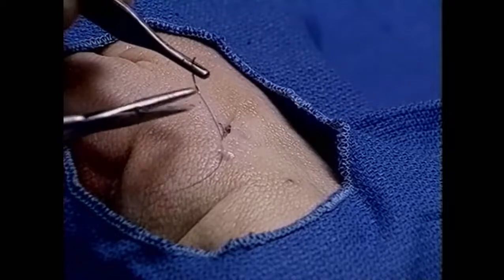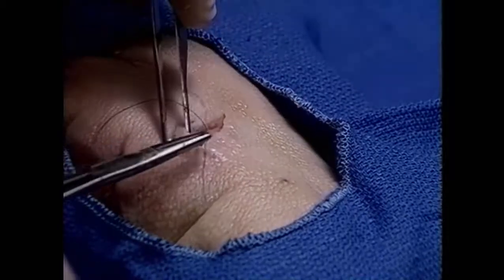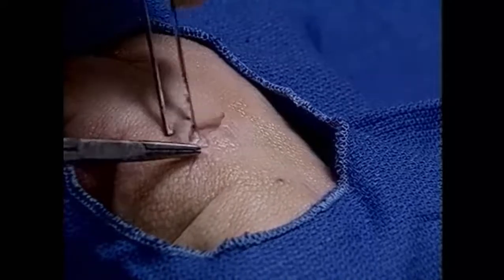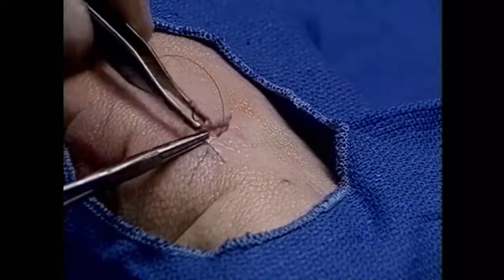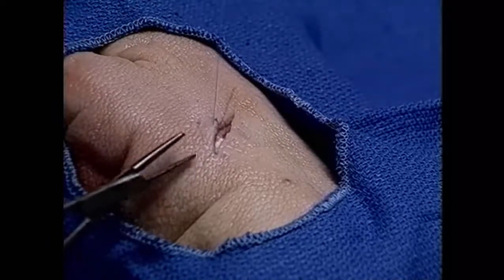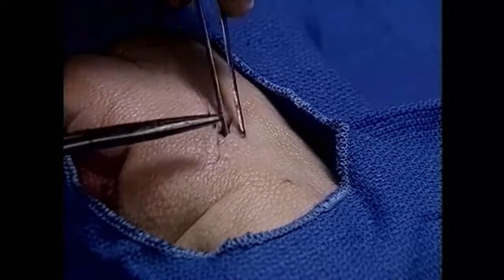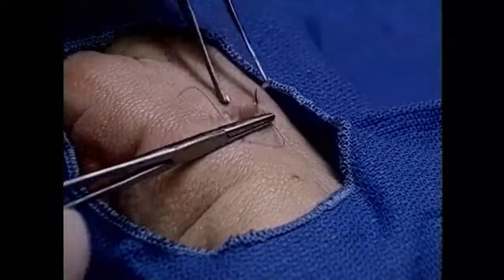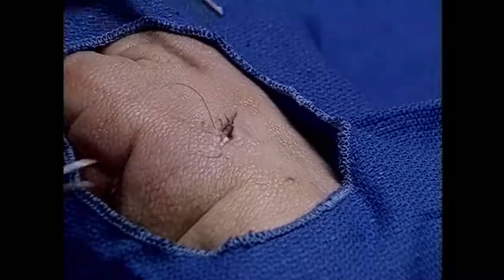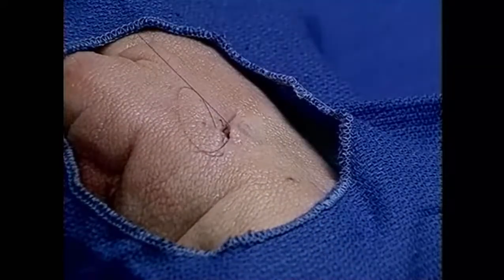One then weaves back and forth underneath the surface, just a millimeter below the skin surface, back and forth until you reach the opposite end. It's okay if you backtrack a little bit, so that you actually enter proximal to the exit on the opposite side. This is all just underneath the surface.